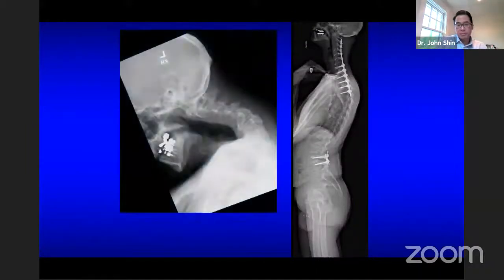And you can see here what that looks like. And now this is a full standing x-ray. You can see when he's standing, what I did in the front was I did not plate that patient. I did not plate anteriorly. So with the posterior releases, I'm able to loosen up the spine. Then with the anterior approach, Caspar distraction posts, anterior osteotomies, aggressive resection of the anterior osteophytes.